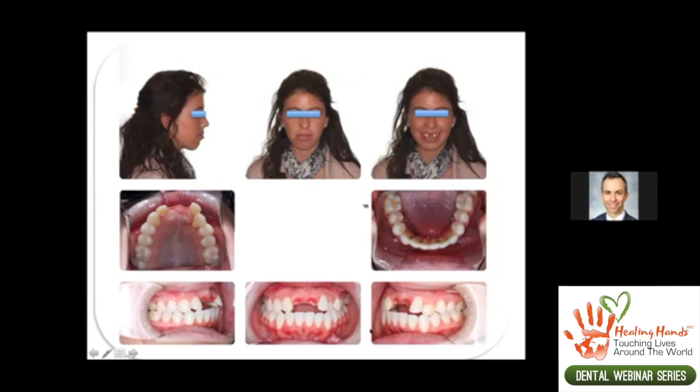So this can present a challenge too, but she was already post-orthodontics. You can see those lower incisors are a little large, so there may be a little Bolton discrepancy there. You can optimize a case like this if the patient is in the middle of orthodontics. You can have the orthodontist perform some interproximal reduction, so IPR, and retract those lower incisor teeth, especially if they're a little bit labially proclined.